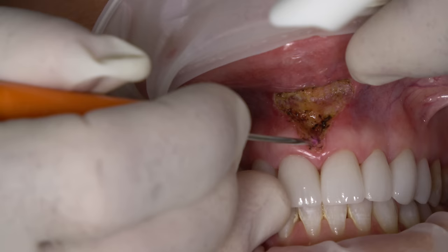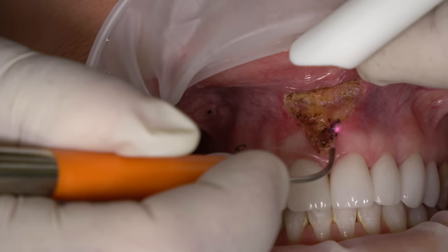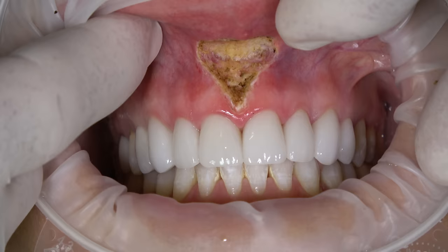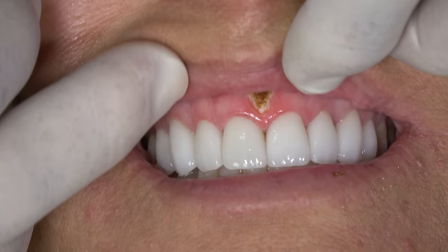Post-operative care for Erica would be just to keep that clean. I'll give her a little chlorhexidine to rinse after she eats. The nice thing about the diode is it seals the nerve endings as well as the capillaries. Sometimes spicy food can irritate the site over the next couple days, but she'll do great.